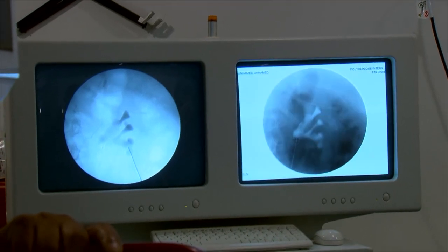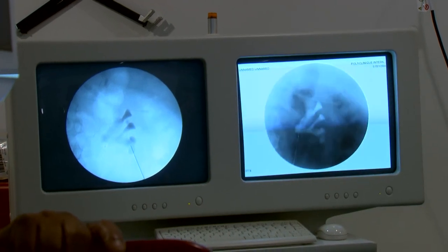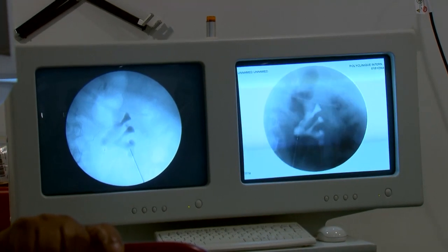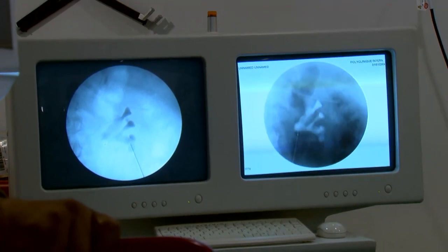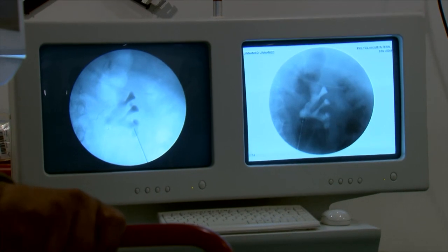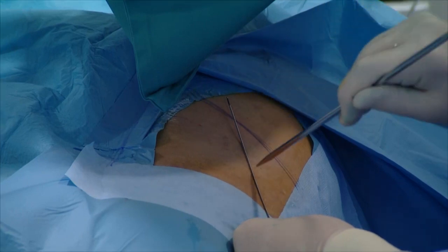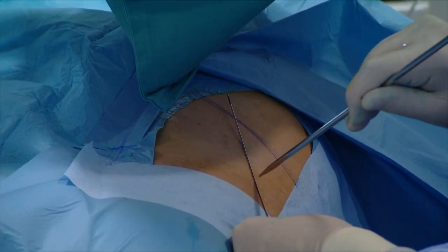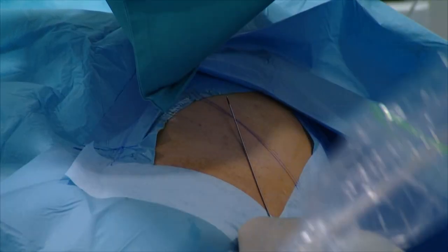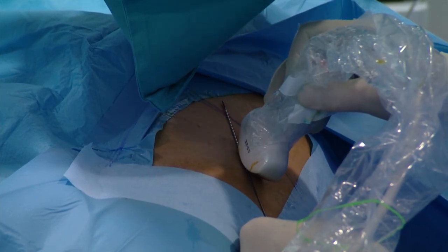Now I know exactly that in this position my target area is located. If I would do a puncture like this, I would exactly hit the lower calyx. But of course this is not recommended because I need a certain angle, which means the puncture is not done in this position, but at some other position on this line, in order to get a certain angle. And this angle is determined by ultrasound. I take my ultrasound probe like this and put it exactly on this line, because I know this is the best line to approach the lower calyx.